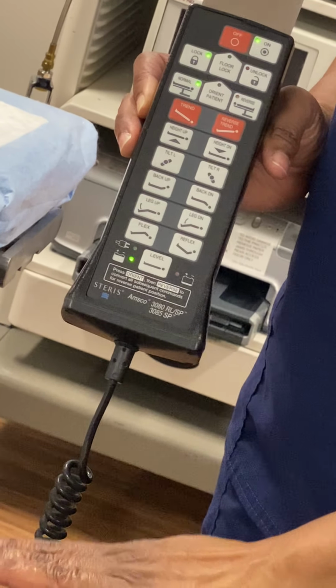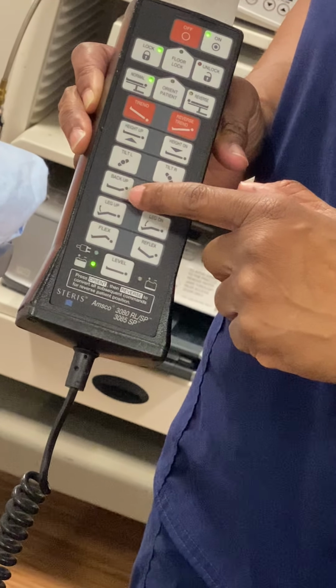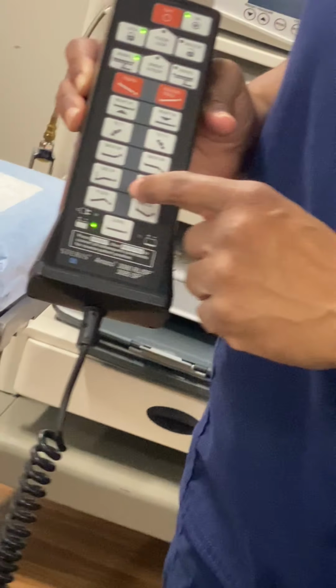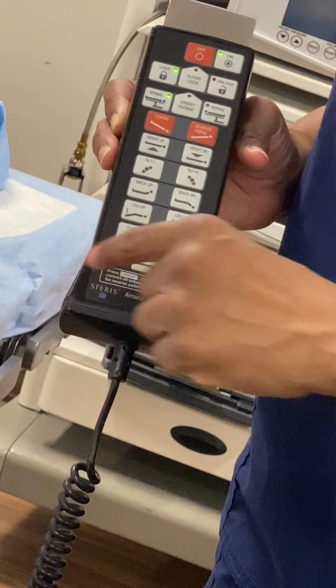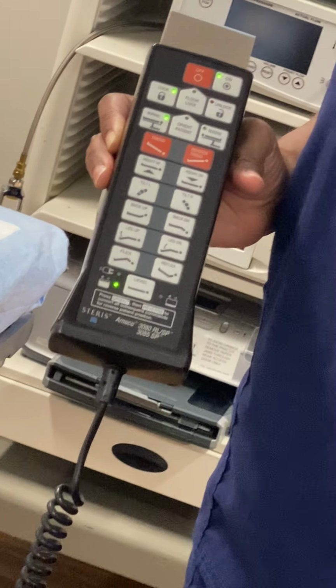The tilt is tilting it to the left or right if he wants the opposite. The back is right down here, and we've already got the patient up. The legs up, the legs down, the anesthesiologist will be doing all the turning. And flex, okay? For certain cases, you'll flex the bed.